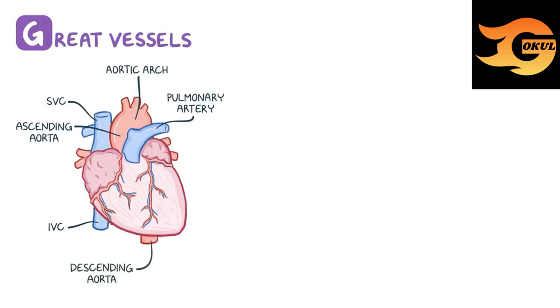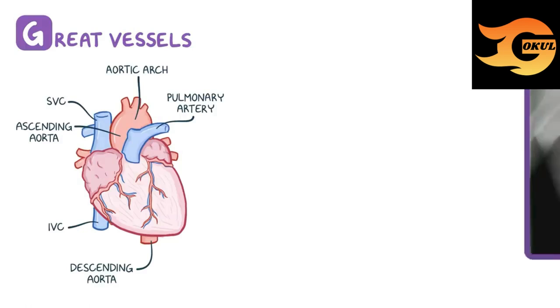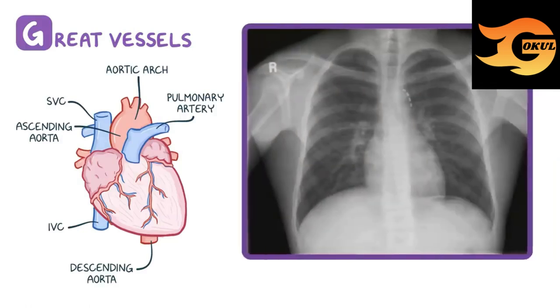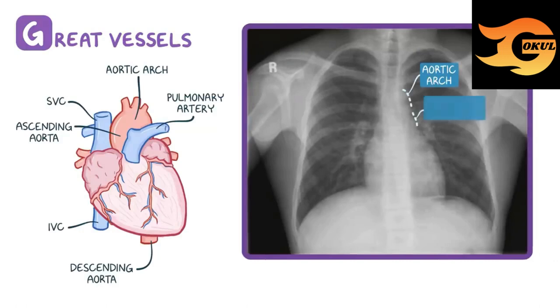You want to make sure that all of these structures are in the right location and is the right size. On the left side of the heart, the aortic arch should be the highest up, followed by the pulmonary artery.